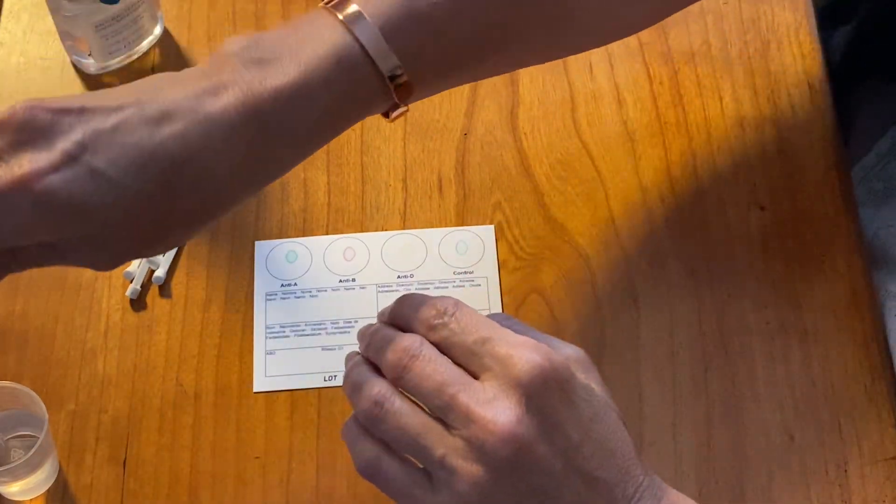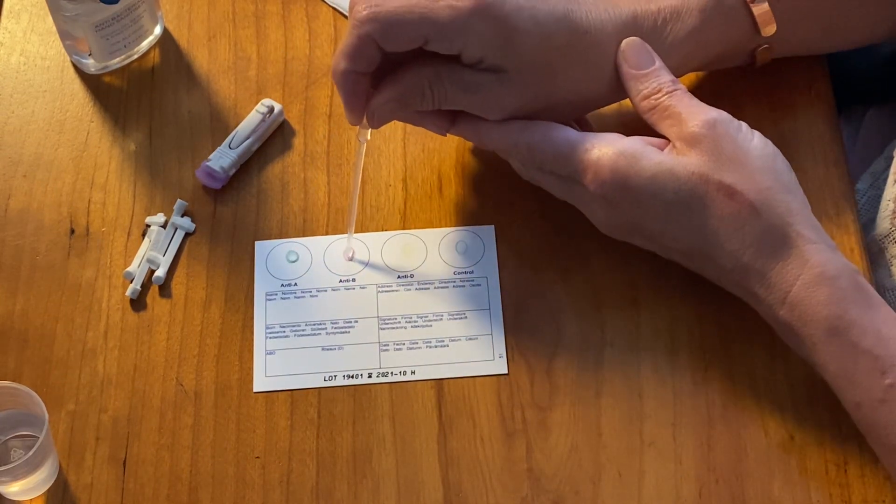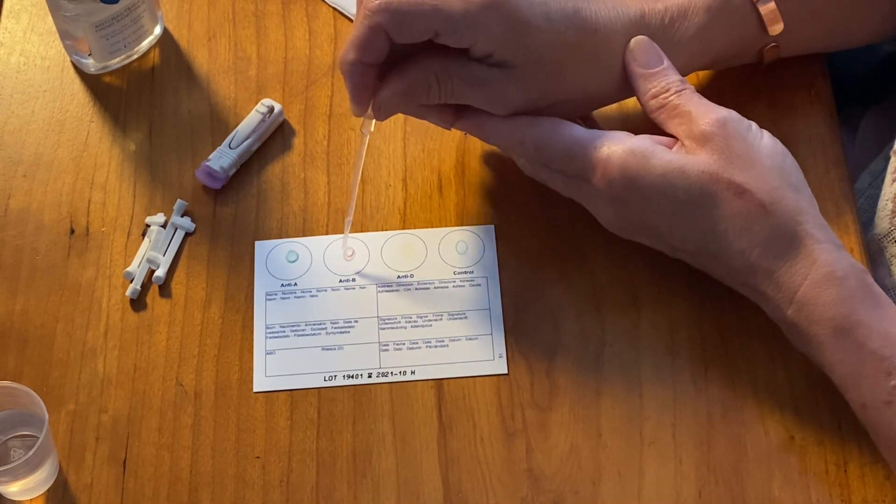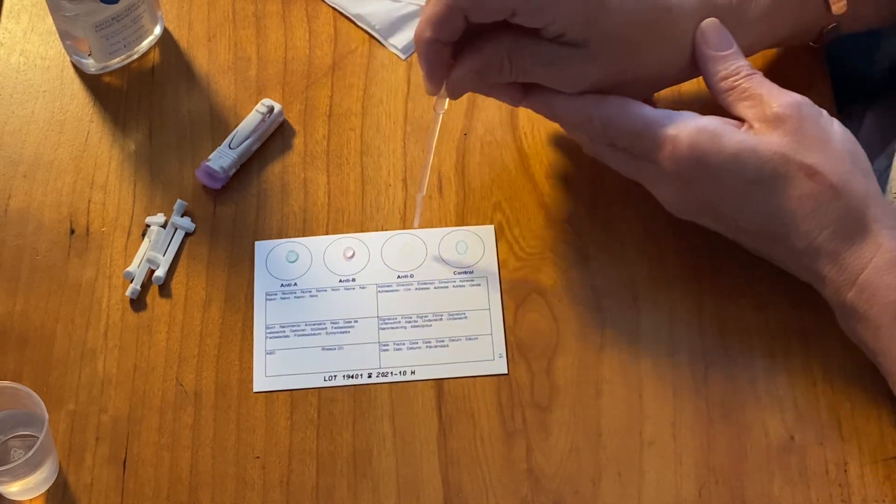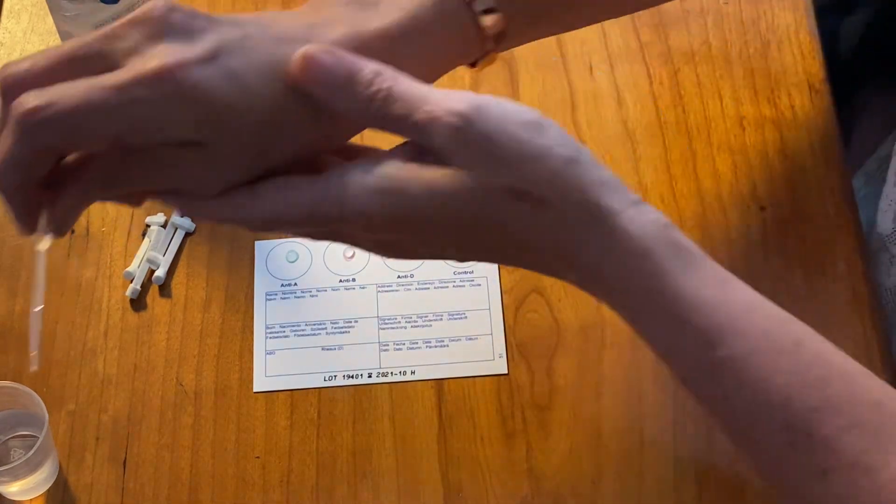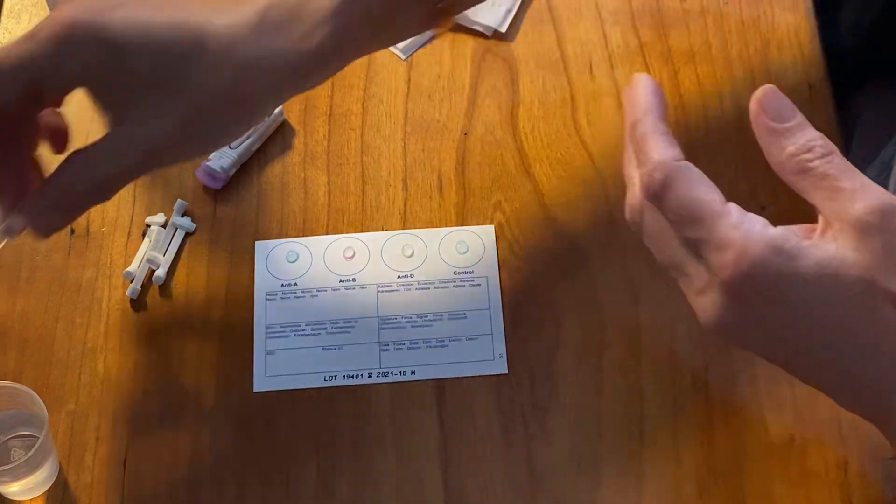To start with, we fill up the plastic dropper with water and put a drop in each of the circles to fill it. Make sure you have enough in. There you go.